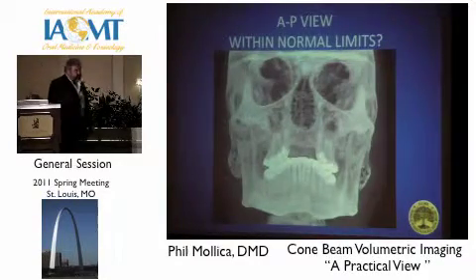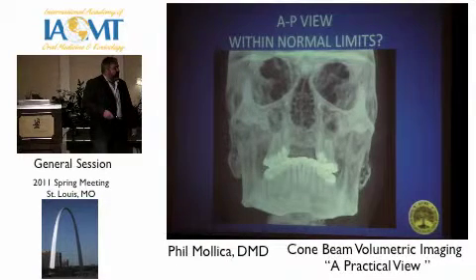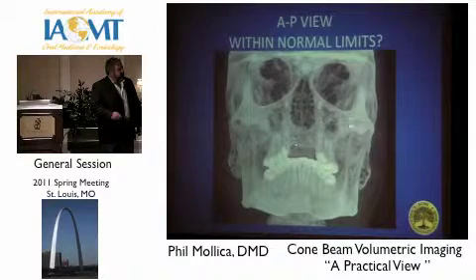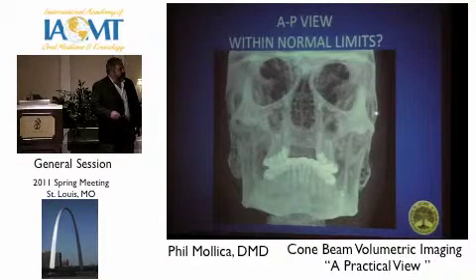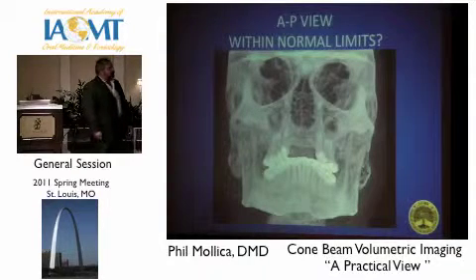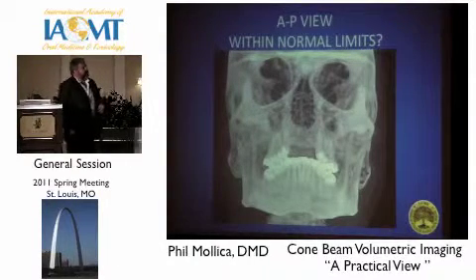So, once again, we start going through our renderings. You saw the pan. I mean, I have all kinds of cool things to look at. I'm looking here, and everything looks pretty normal. There's no big holes in his head or anything I can see here. I said, okay, well, let's take a little bit different view.